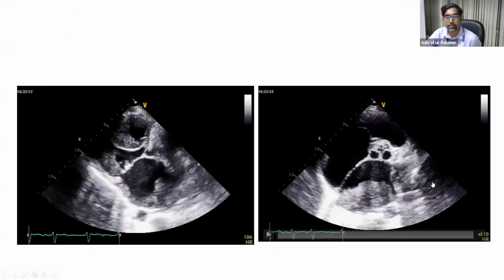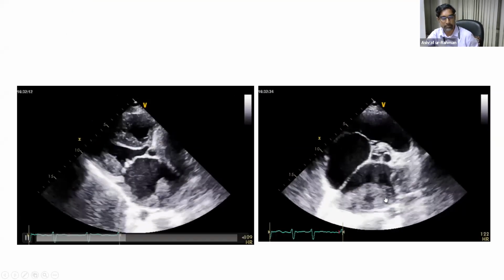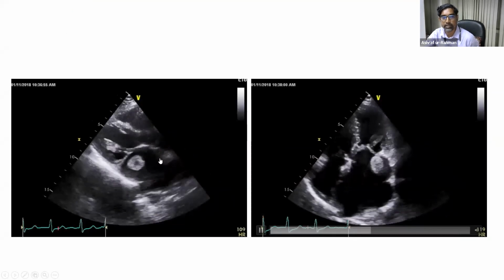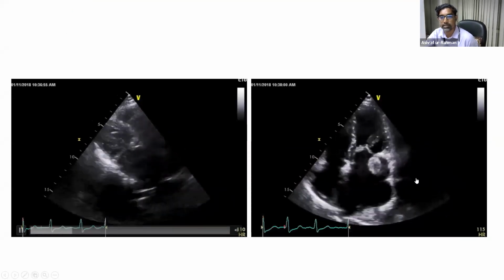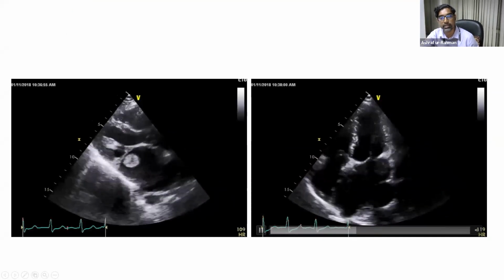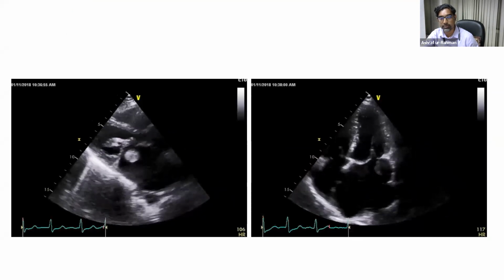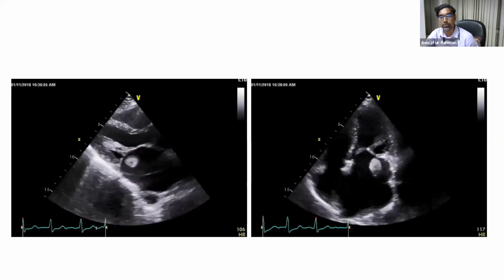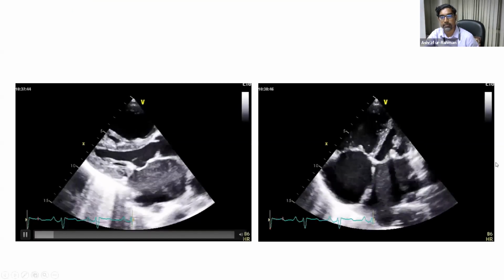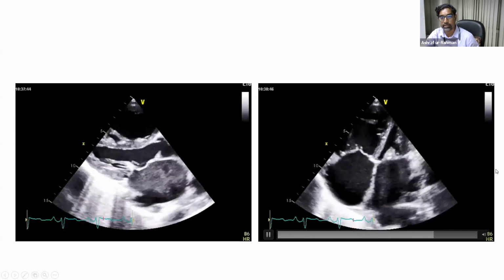This is a clip showing some thrombus in the LA, and this is another clip of a rounded thrombus in the LA, and the LA is usually enlarged. You can see, MS often causes thrombus in the LA, and sometimes these are easily visible in the transthoracic echo also. This is spontaneous echo contrast in the LA, and you can see the RA is quite dilated.